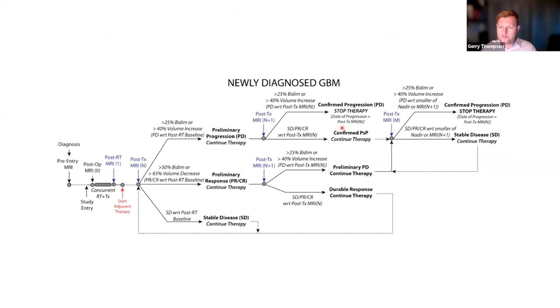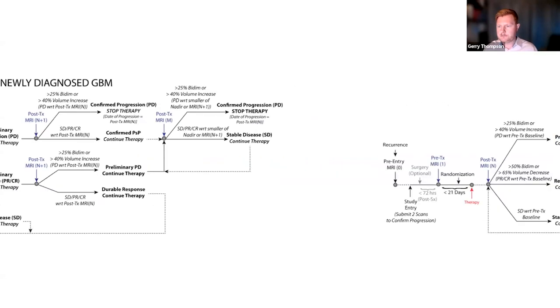And there's quite a complex rubric in the modified RANO from 2017 to account for the fact that enhancement doesn't always mean active disease. And this is one of the reasons why having a digital tool is quite useful, because instead of someone locally inputting numbers that are on a paper bit of assessment filled in by a radiologist, then converting that and following this rubric to try and decide what the outcome was, this is all taken care of. They add in the relevant clinical data on imaging upload. The radiologist then does the assessment online, and in the background, the outcome of the RANO assessment is calculated.